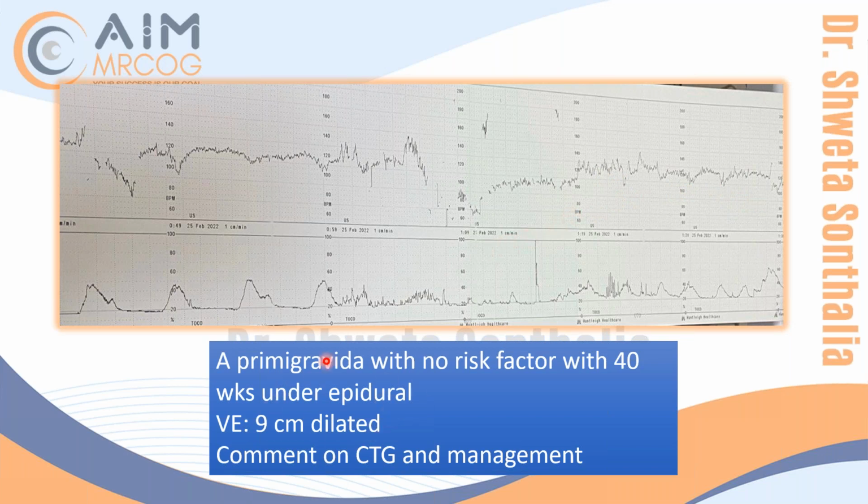She is under epidural. Maybe she has received it earlier. The thing is, if I give epidural here, I may say that it is because of epidural. But if she's already under epidural, it's only in the beginning, not after that. After that you give them fluid and monitor the output. Usually if they give you a trace of bad CTG after epidural, it will be immediately after epidural. But yes, if I give epidural here, it could be because of epidural as well, due to hypotension.